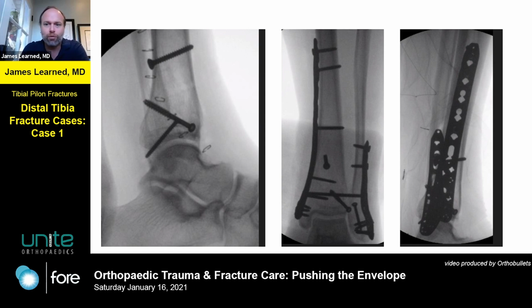And when I see people put 2 pins in the tibia and connect them with one of those little bullhorn connectors, and then a pin across the calc, and then they just kind of pull and pray, that's the method that just never achieves a reduction, because you have no ability to control things in a logical, stepwise manner. So I like to get my length with my first set of implants in an X-fix, and then slowly build in my reduction and my stability by adding more bars and clamps, depending on what sort of forces they need to reduce it.